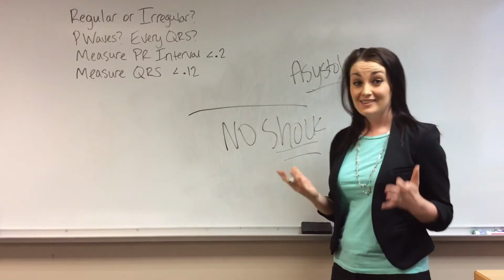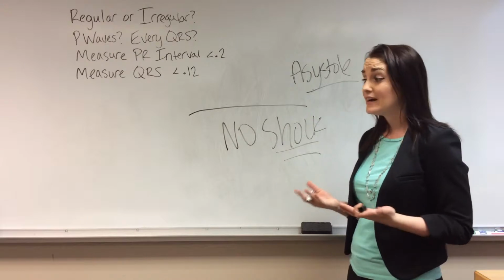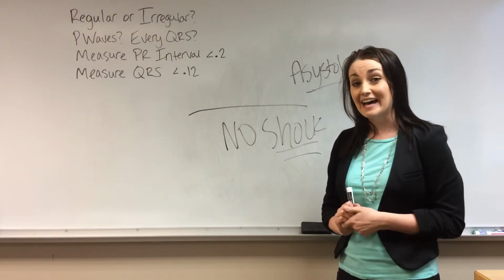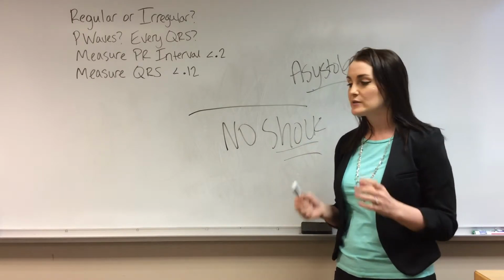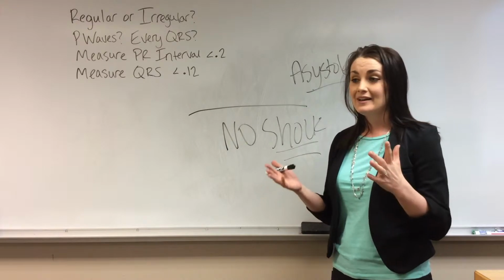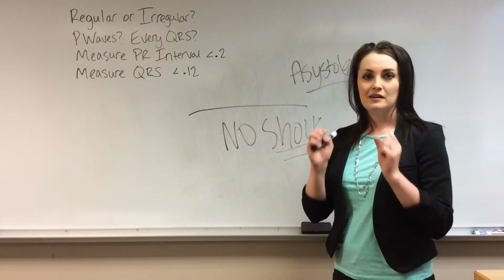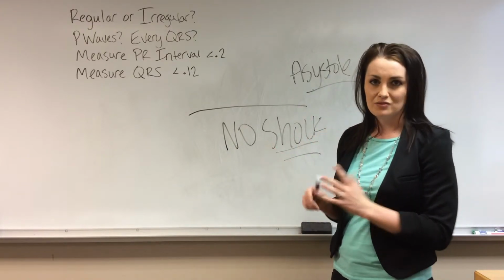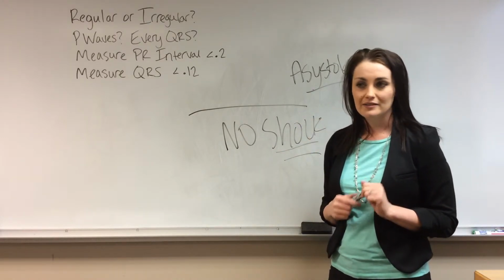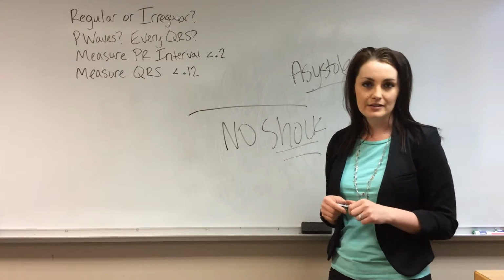And so why do you think that might be? It's because those ventricular dysrhythmias, as I talked about, I emphasized that there was something to shock, right? There was still electrical activity going on, even though it's not what we wanted. There was something, so we could intercept it and shock it and try to get it in its normal rhythm. With asystole, there's no electrical activity going on. There's nothing to shock. There's nothing to intercept.